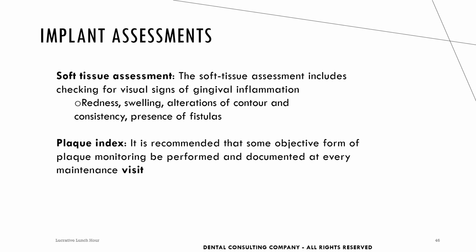Soft tissue is important to assess, and you want to document tissue consistency, contour, and color. It's also recommended to document plaque index at every maintenance visit.